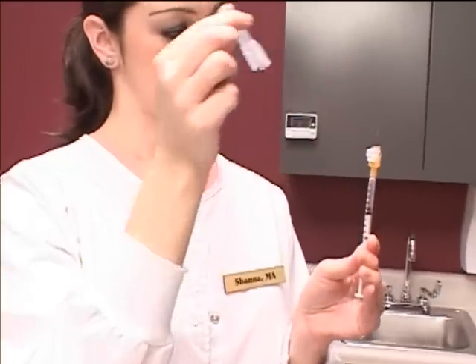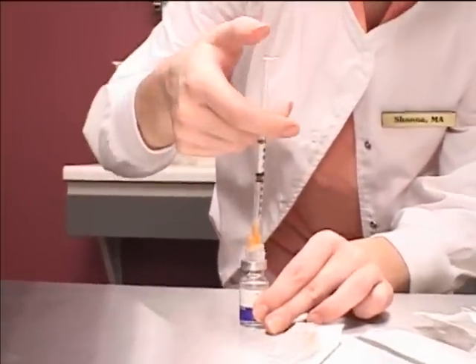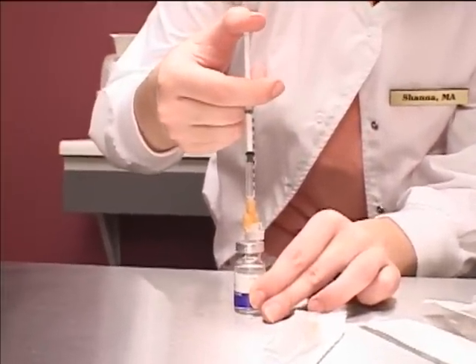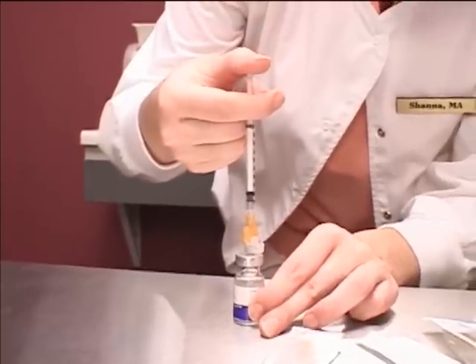Uncap the needle and lay the cap on a clean surface. Place the needle in the center of the vial and inject the air slowly. Injecting quickly may result in air bubbles that can affect the accuracy of the withdrawn dose.